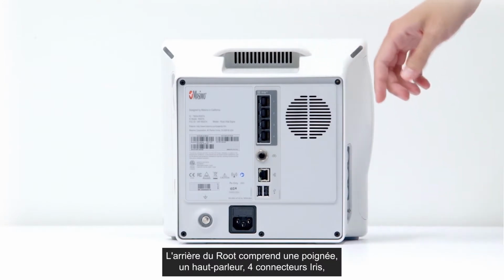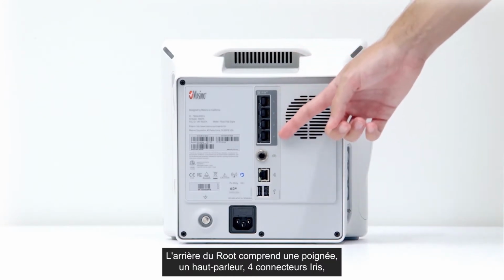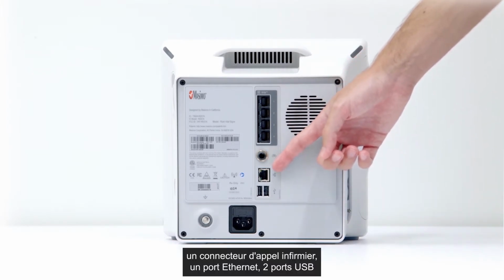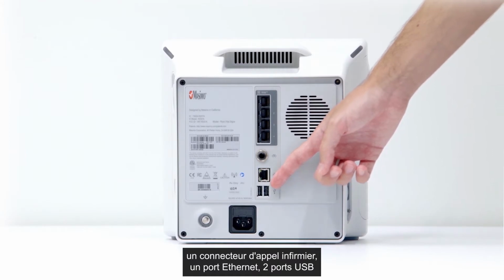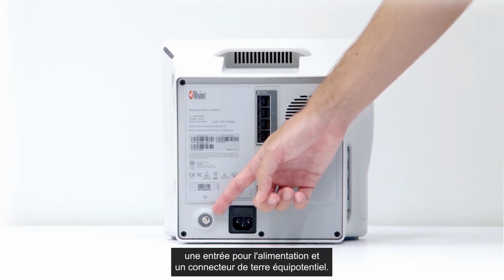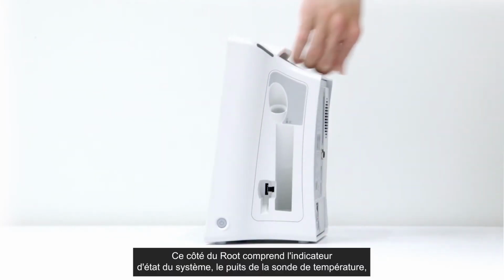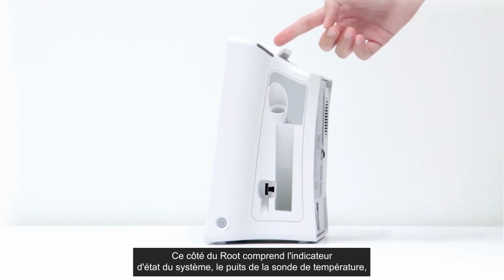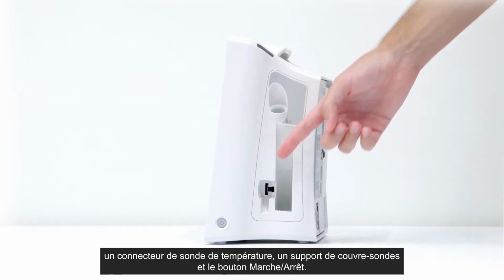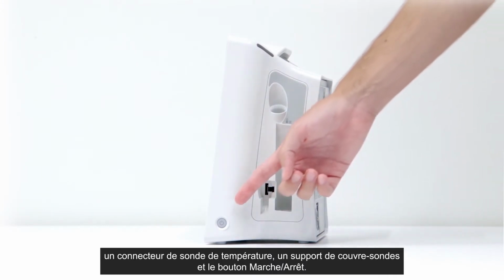The back of the root has a handle, speaker, 4 iris connectivity ports, nurse call connector, Ethernet port, 2 USB ports, power entry module, and equipotential ground connector. This side of the root has a system status light, temperature probe well, temperature probe port, temperature probe covers holder, and the power button.